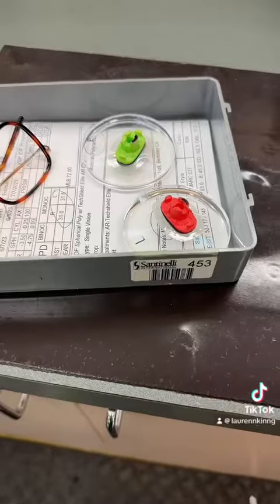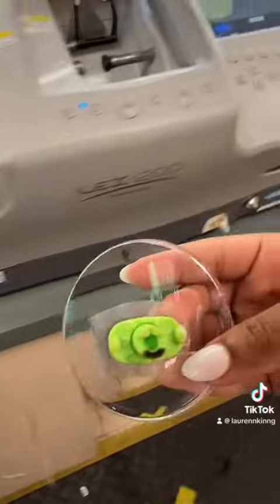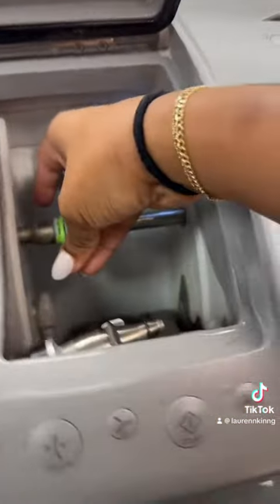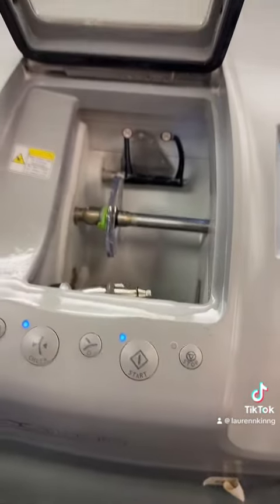After a successful blocking, it's time to edge. We scan the tray, verify the tracing, and pick out the designated lenses. First, we start with the right lens by pressing the chuck button and then pressing start so that the lens can begin its edging process.